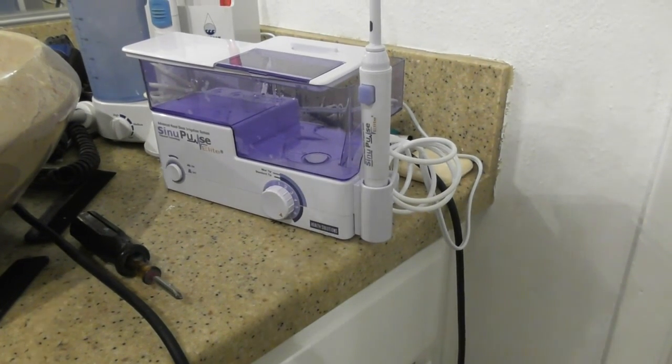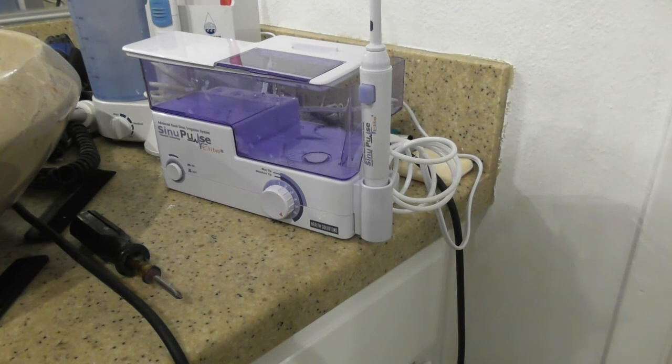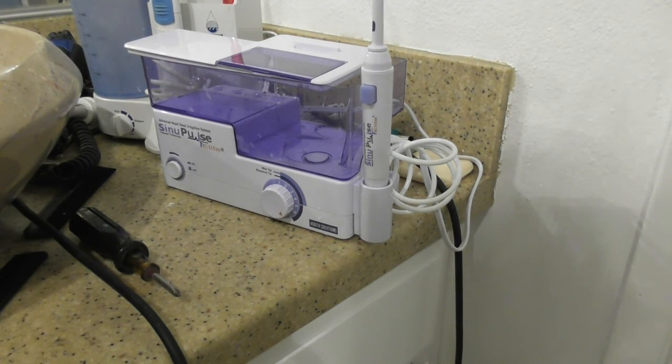A quick update ten minutes after using the unit: I am breathing clearly out of both nostrils, which never happened with the other unit — I was always plugged up. Ten minutes later, I don't have water running out of my nose and I don't feel like water is stuffed inside my sinus cavities, which I always experienced with the other unit. I'm rating the SinuPulse as awesome. I will be using it all the time instead of the Grossman, which will now be discarded. It really works, is well worth the money, clears up your sinuses, and gets rid of all that stuff in there.